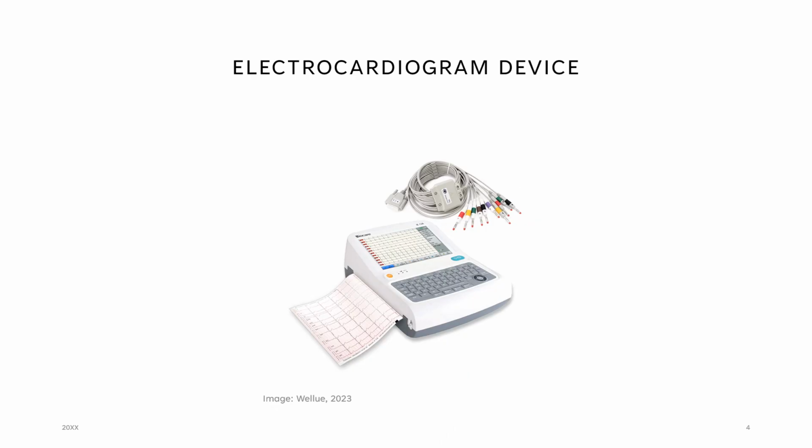So here's an electrocardiogram device, a simple one. The ECG can also help your physician in diagnosing an unusually fast heart rate, which is tachycardia, or a slow heart rate, which is bradycardia. The ECG can provide information possibly on previous heart attacks by showing which areas of the heart may have been damaged, or a current heart attack that is ongoing.